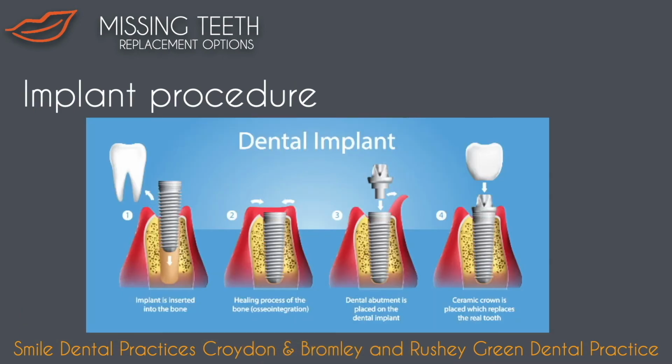So, let's talk about the implant procedure itself. The implant procedure is done in several stages. Firstly, we painlessly place your implant where your tooth used to be. We then need to allow 2 to 3 months for the area to fully heal, and we want to do that without putting any tooth on top, so the implant can heal into the bone without any movement.